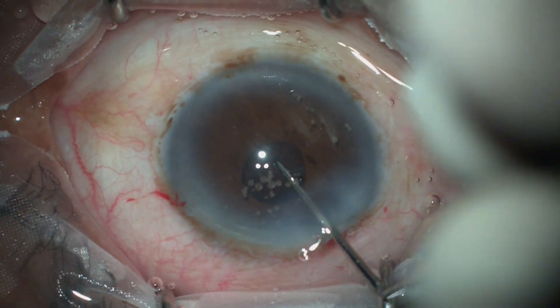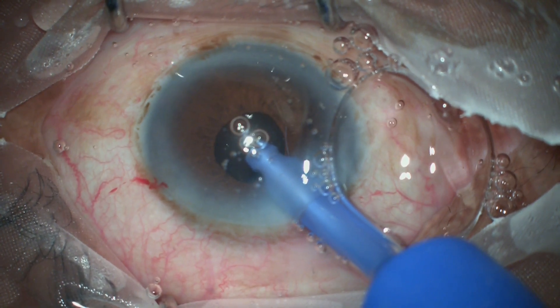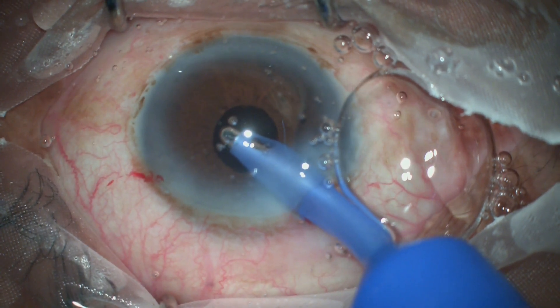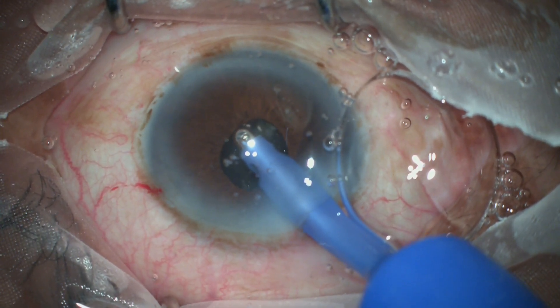With the small pupil, the remaining viscoelastic gel is removed. There is no cortex left behind — actually there was never any cortex requiring aspiration, as it was all liquefied cortex that was easily removed.